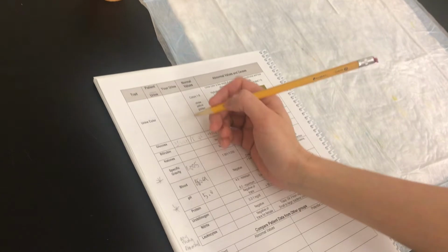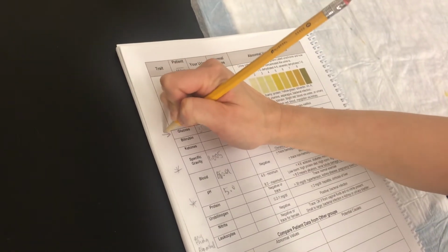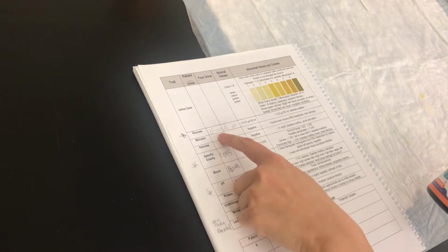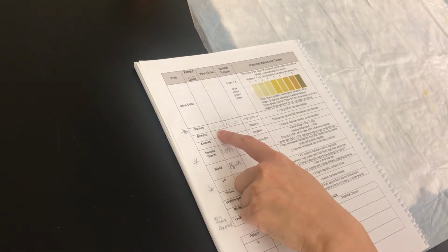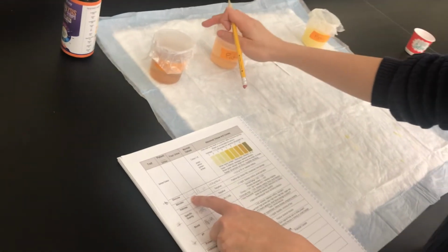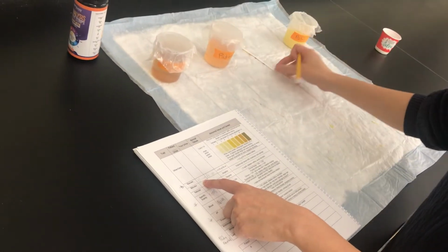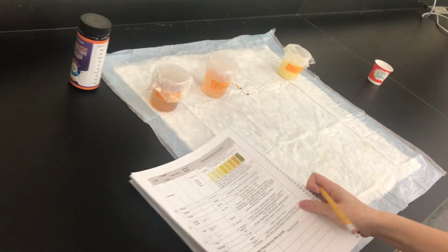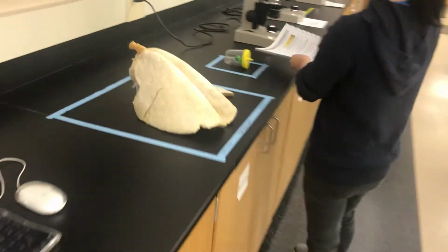And my diagnosis for this particular patient is, because glucose is so high right here, it's very likely that this patient has diabetes and should actually have a fairly high specific gravity, even though it doesn't show it here. And one way that old-timey physicians used to test whether or not their patients had diabetes would just be to taste their patient's urine and see if it tasted sweet. If it tasted sweet, then yes, we have a positive diagnosis. Luckily, we have dipsticks now. It's great.